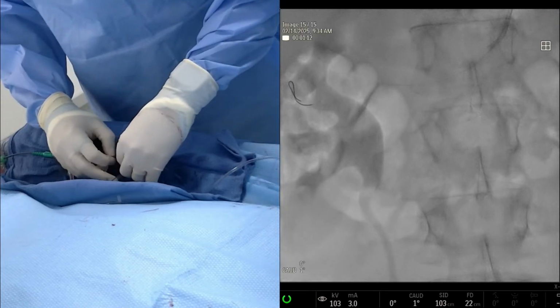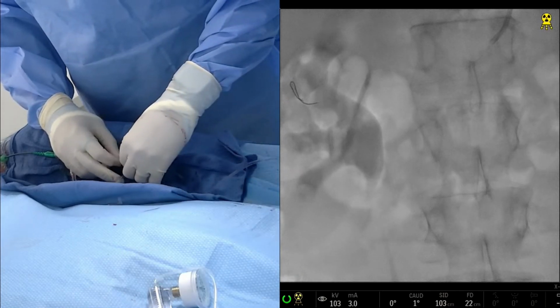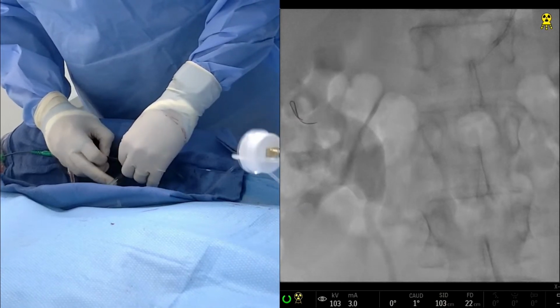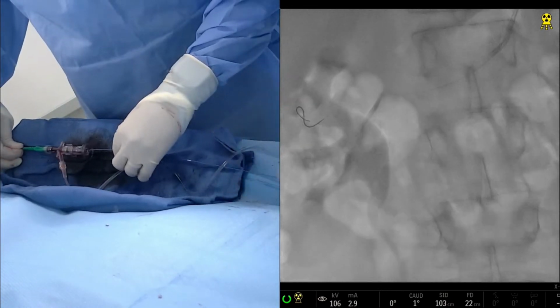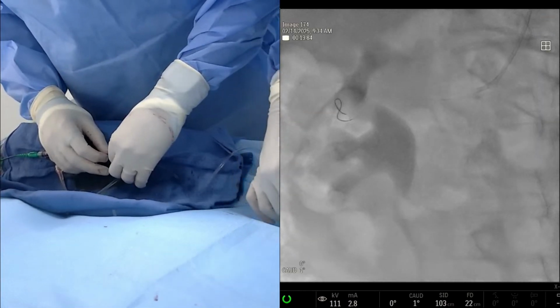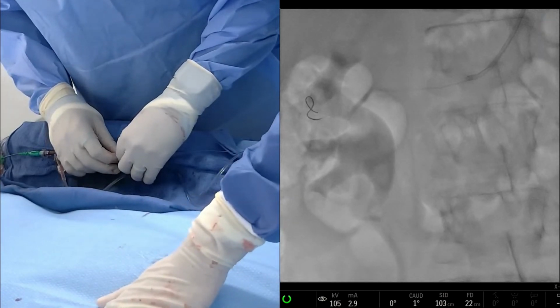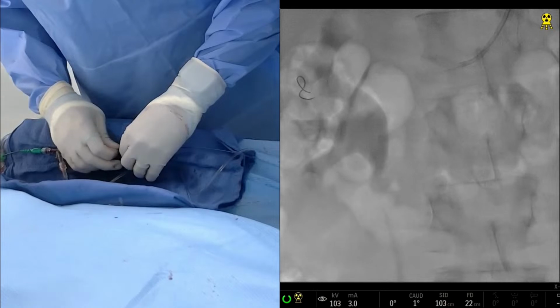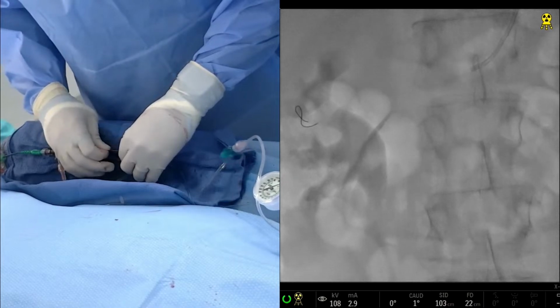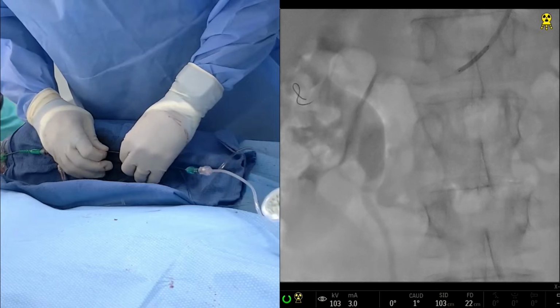And so we don't have all the answers. Just as an aside, if you look at the global demographics, where most of the patients with large vessel vasculitis at this age show up, it's in countries where they don't have the resources or the experience to use, for example, drug-eluting stents. And sometimes they're not even using dedicated renal stents either. So we're using our best judgment, and we're trying to do what's best for the patient to make sure that they have a very good outcome and, God willing, a very durable outcome.